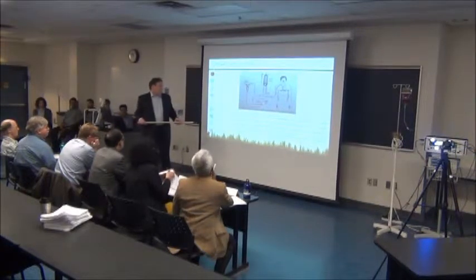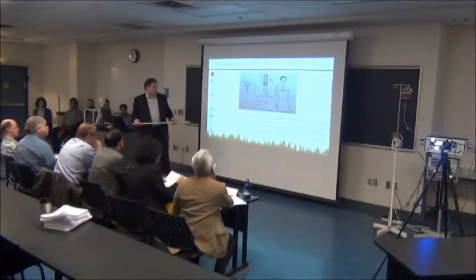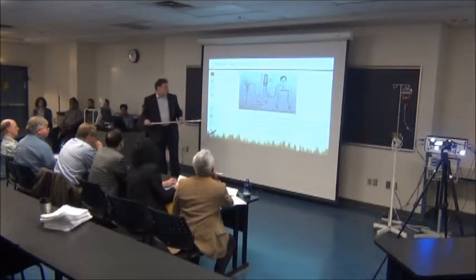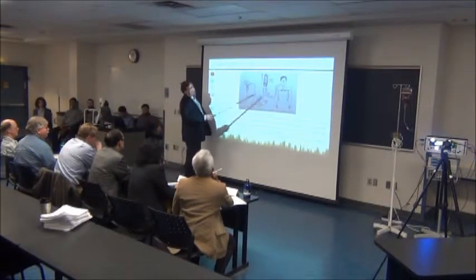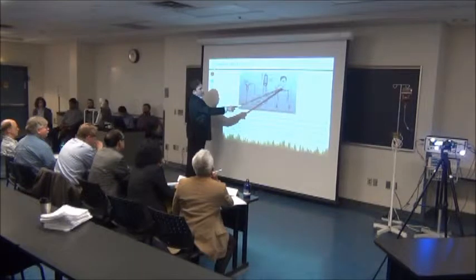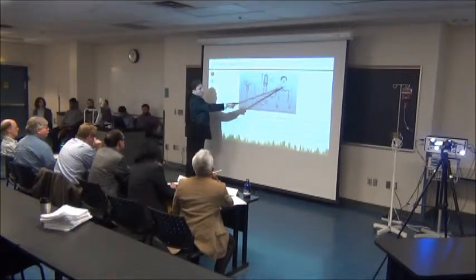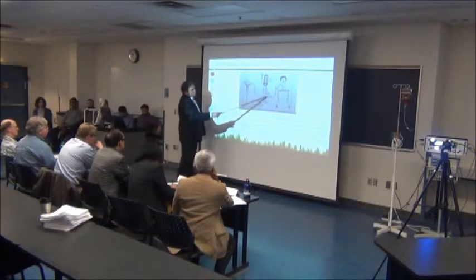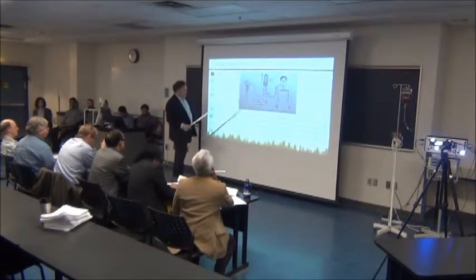The tubing and transducer are filled with saline solution from the IV bag, purging the line of any air bubbles. The tubing containing a continuous column of saline conducts the pressure wave created in the heart directly to the transducer. So essentially, the heart is creating pressure waves, almost like a sound wave. The pressure wave travels down the artery, through the tube, and into the transducer.